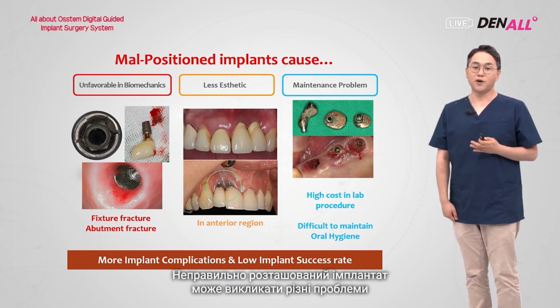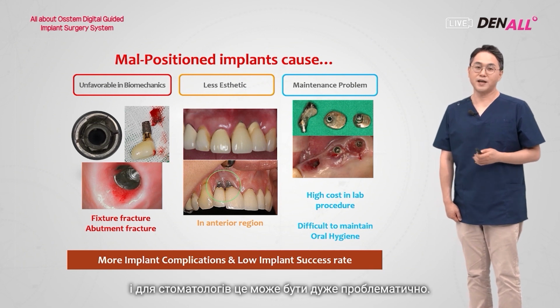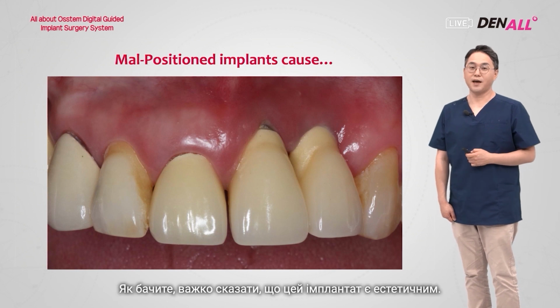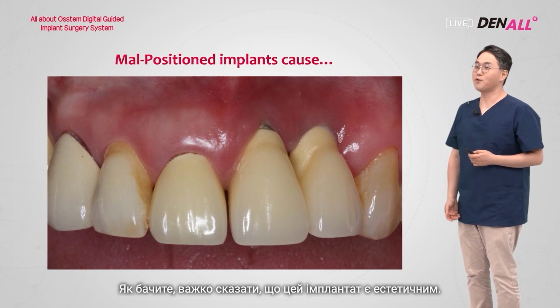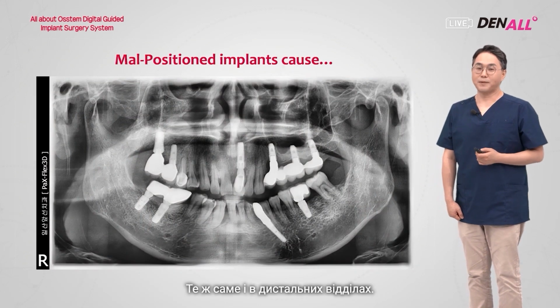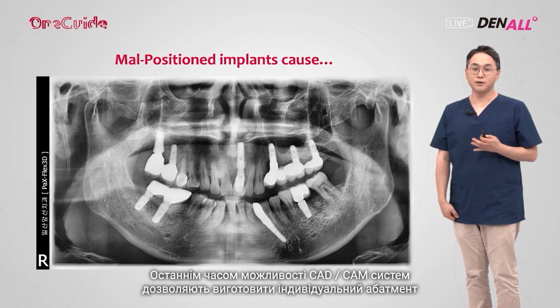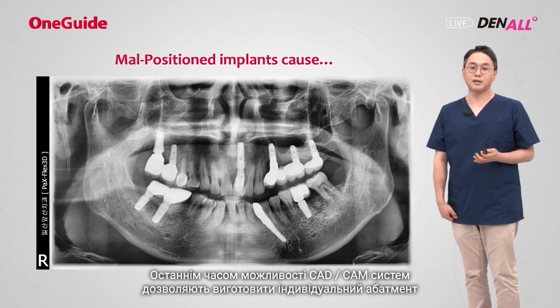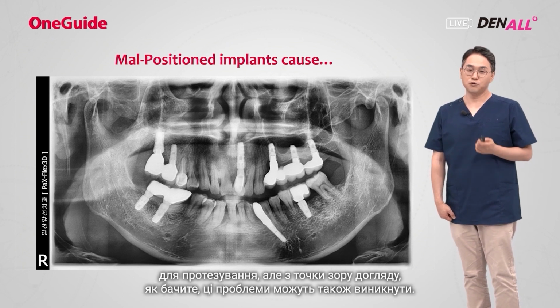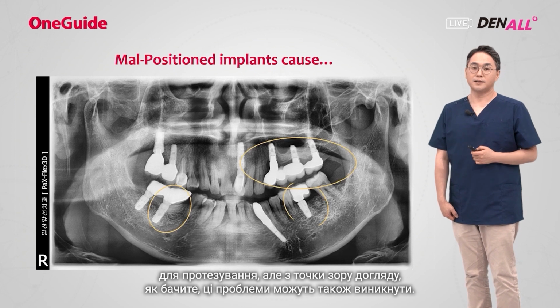Malpositioned implants can cause various issues, and for dentists, it can be very problematic. As you can see, it's difficult to say this implant is aesthetic. It's the same in the posterior area. CAD-CAM abutments are recently used a lot, and people use custom abutments for prostheses, but in terms of maintenance, as you can see, these problems can occur.